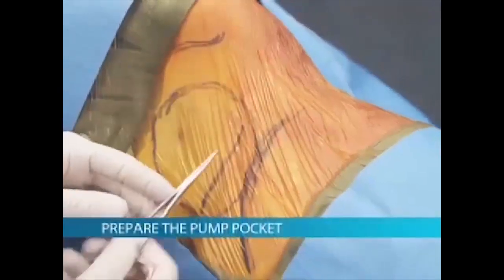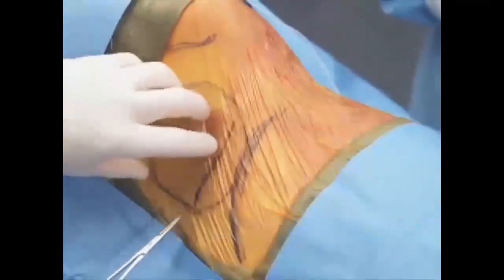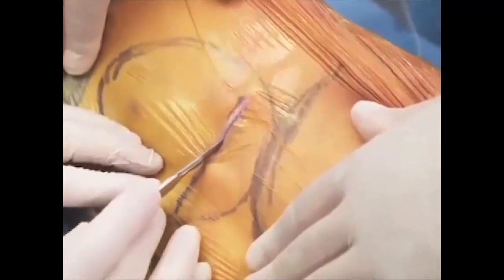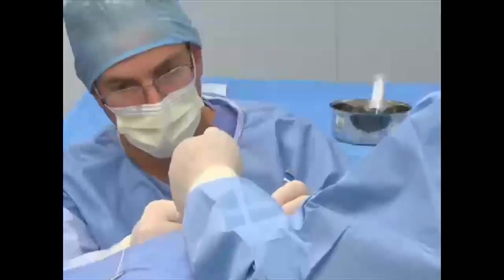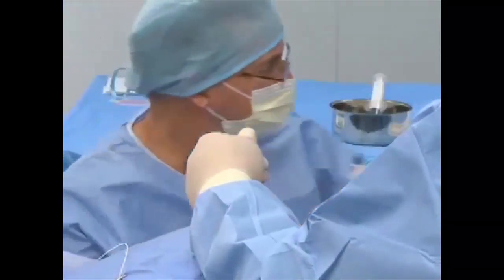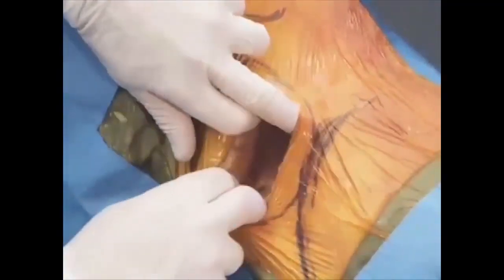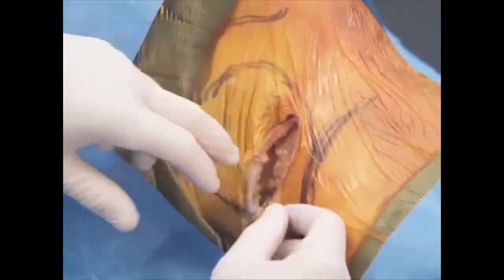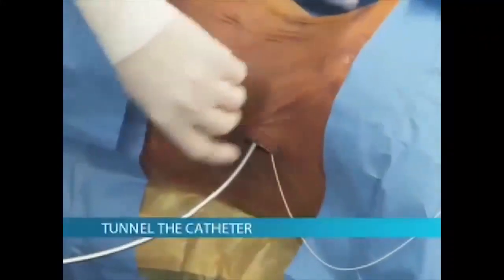The next step is to prepare the pump pocket. Make an incision following the preoperative pump pocket markings. The incision should not overlay the final position of the pump. Because fibrous bands in the pocket can be vascular, meticulously use electrocautery to avoid hematoma or seroma after surgery. When finished, the pocket should be no more than 2.5 centimeters beneath the skin and large enough to easily accommodate the pump, allowing a gradual curve of the catheter.